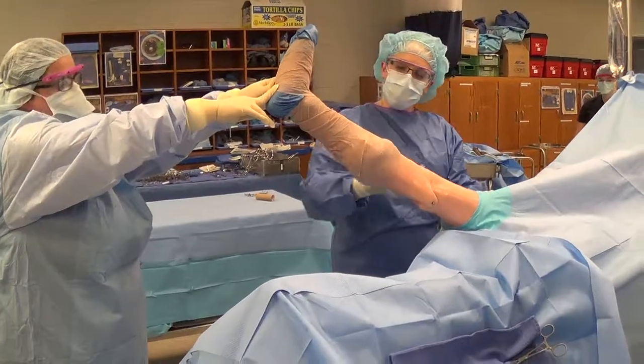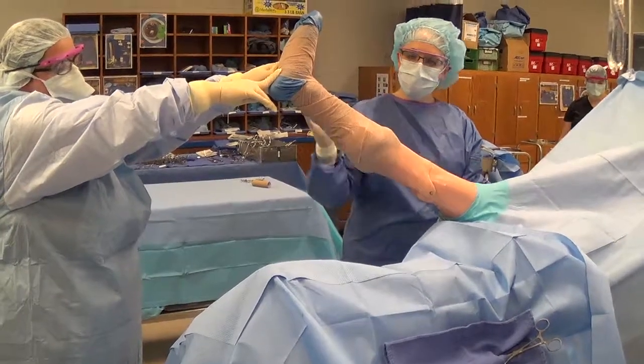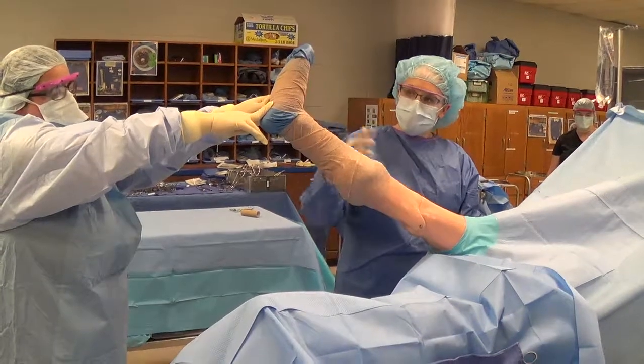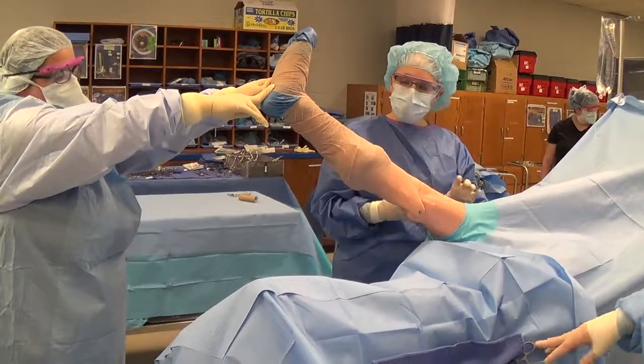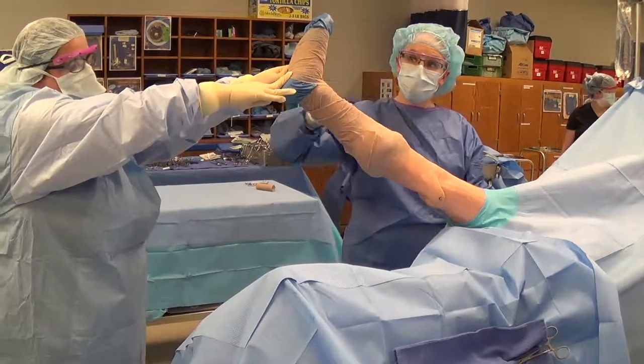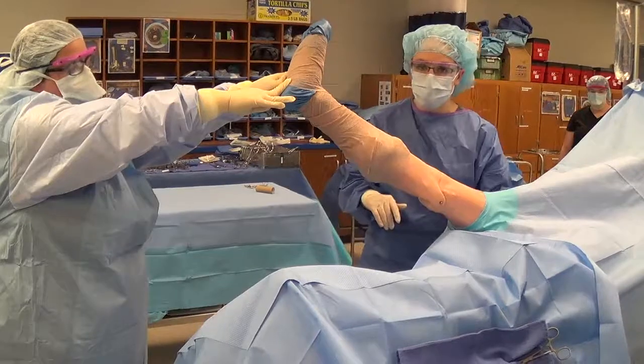We then want to make sure that we elevate the leg until it's wrapped with an Esmarch and the tourniquet is inflated, because this entire time that we've had the leg elevated the blood has been draining out of that leg, which will give us a better tourniquet. Wait until it's wrapped with that blue Esmarch and after they remove it and the tourniquet has been inflated, then we can go ahead and rest the leg down onto the drapes.